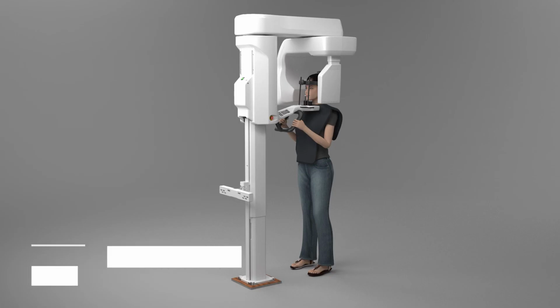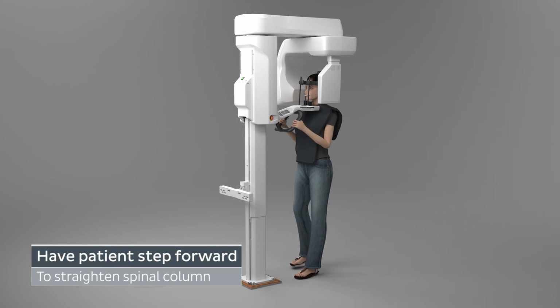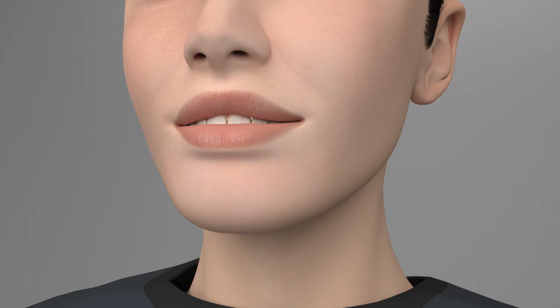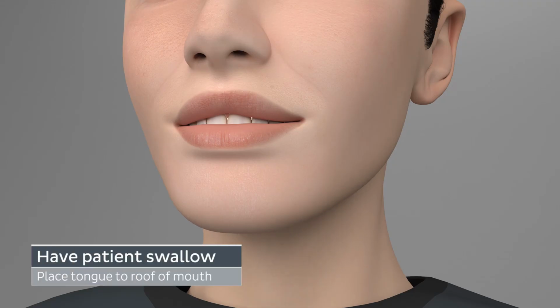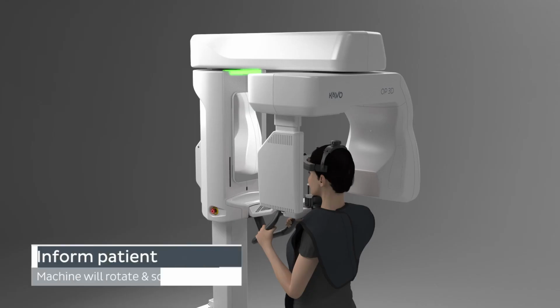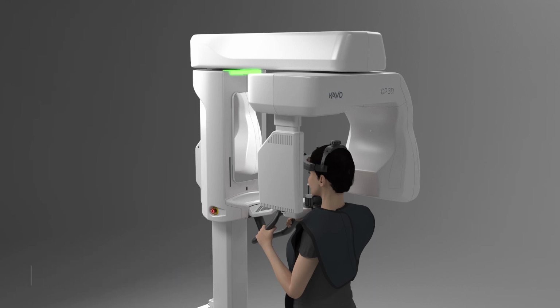Ask the patient to take one step forward to straighten the spinal column. The patient is now slightly leaning backwards and should remain this way during image acquisition. Ask the patient to swallow, place the tongue to the roof of the mouth, and remain still for the duration of the exposure. Inform the patient that the machine will rotate around their head and an audible sound will occur.